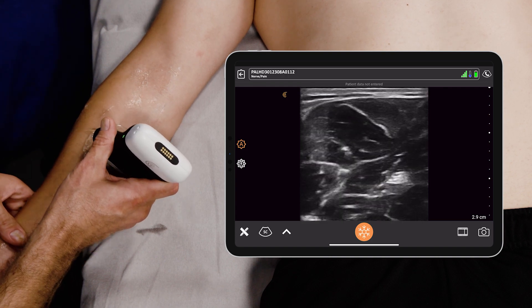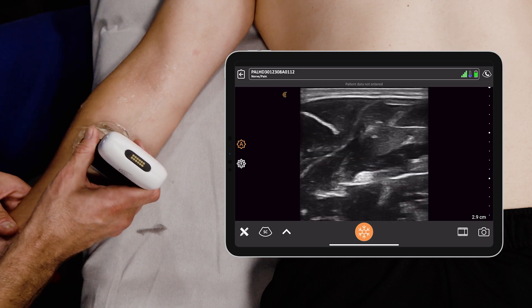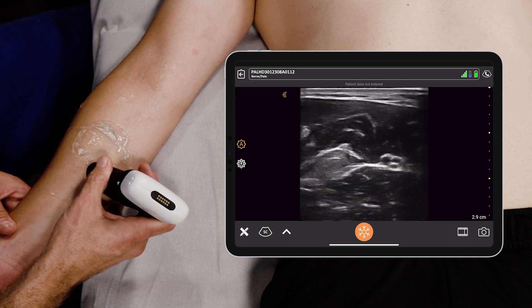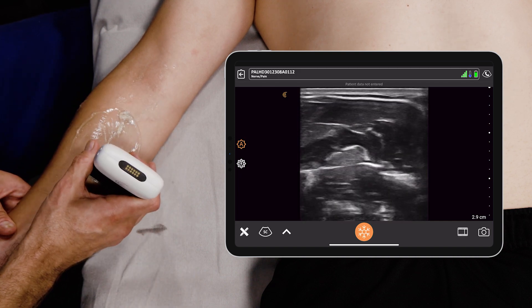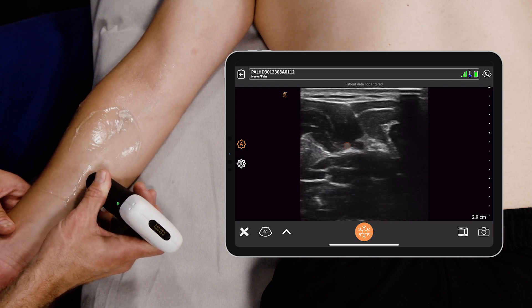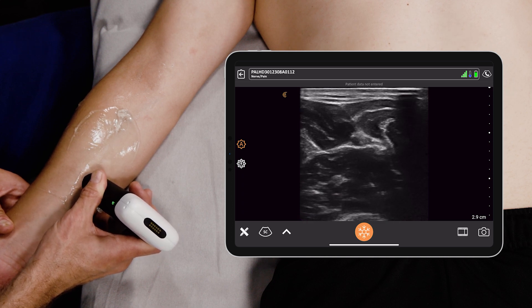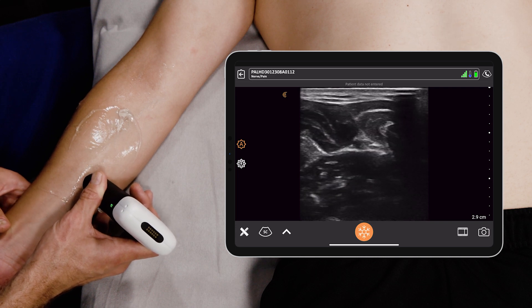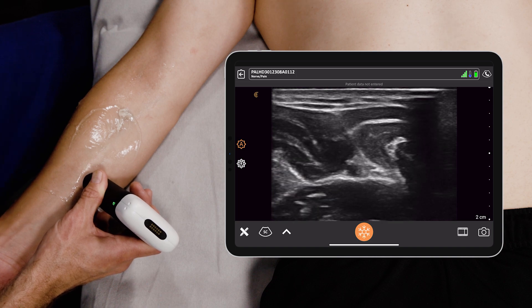I sometimes rotate the forearm over, and what I'm looking for — to be honest — is not the ulnar nerve directly, but I'm actually looking for the ulnar artery, which you're seeing right here. An artery is pulsatile and non-compressible, which we're seeing here. I'm going to improve our depth to look closer.